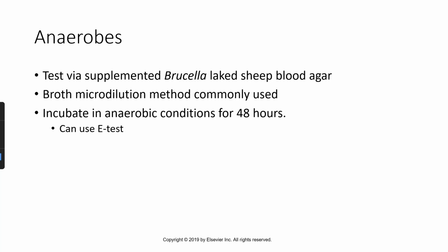Anaerobes are tested via supplemented Brucella laked sheep blood agar. Broth microdilution method is commonly used. You incubate in anaerobic conditions for 48 hours, and you can use an E-test.